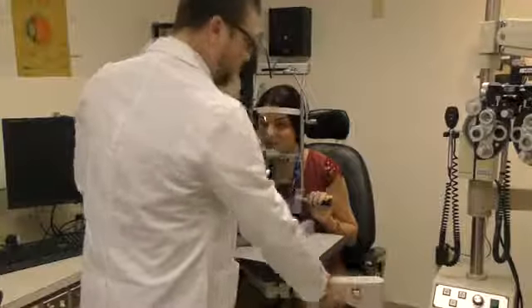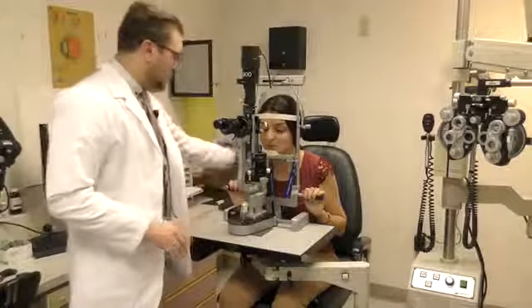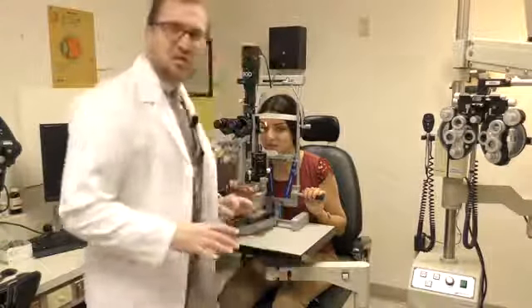That's perfect. Don't worry about it. So I'll take care of her. And so now this is much better. And are you comfortable now? Yeah. Perfect. So now she's nice and comfortable and you're ready to start your exam.